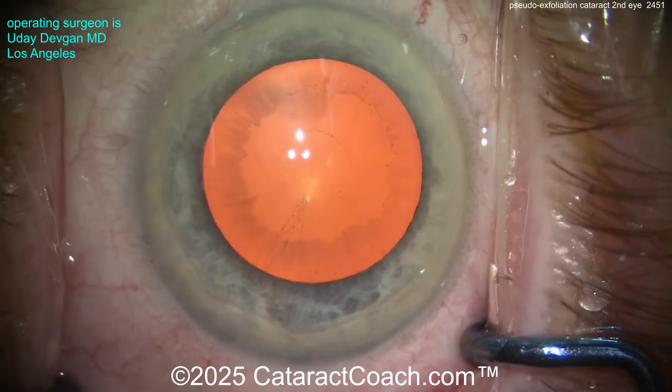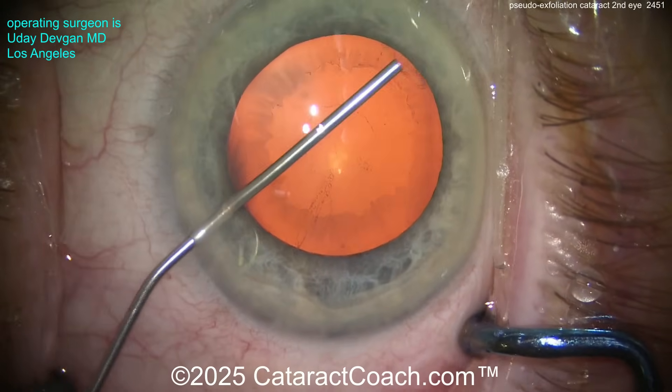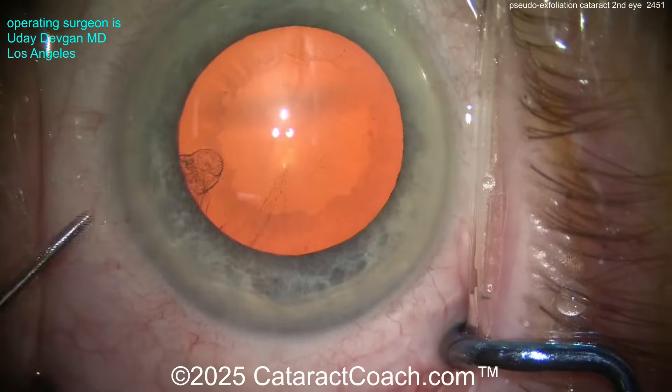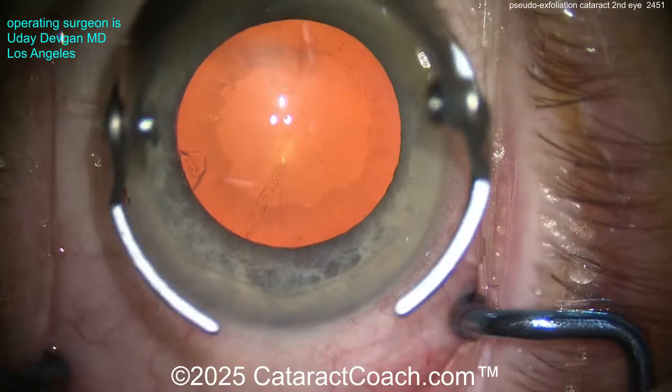On the first eye that has the phimosis, we did a YAG laser capsulotomy of the anterior capsule rim at 12, 3, 6, and 9 o'clock to help break that ring of phimosis, and that's helped stabilize it. So what should we do differently here?